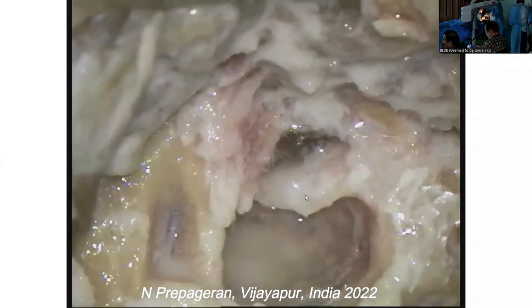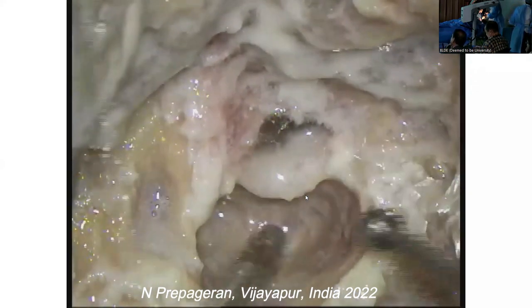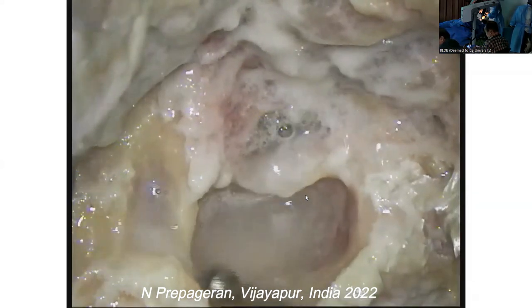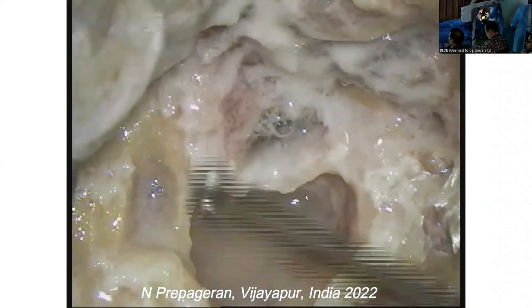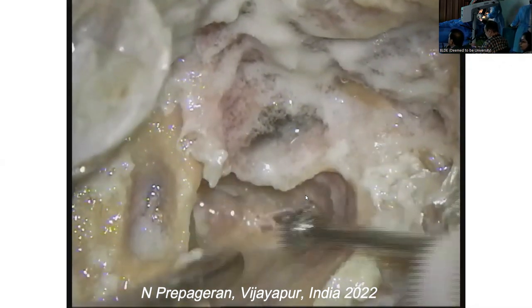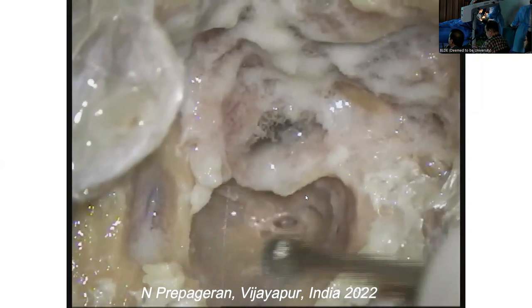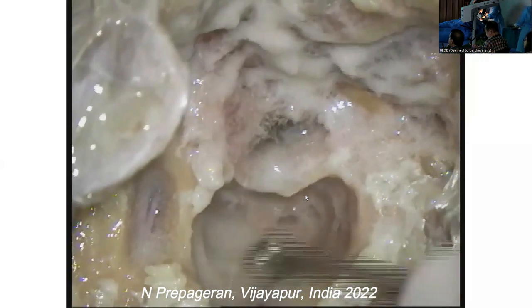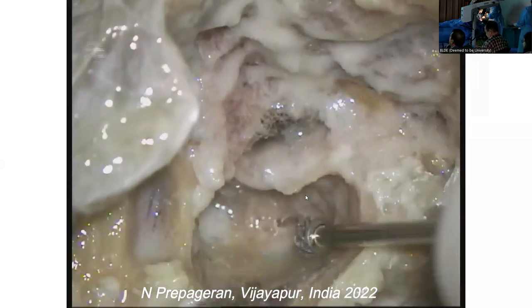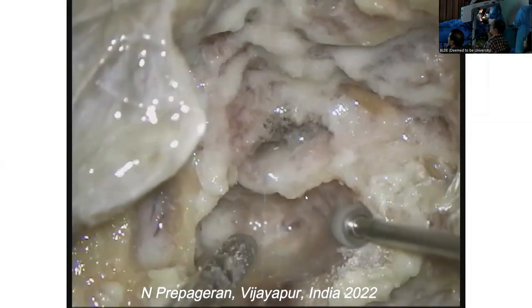So when you do this, you want to do it with a shorter shaft and with a big burr. A small cutting burr like this, you will, so that's the dura of the pre-sigmoid. Okay? So now, that's probably a sigmoid sinus. Guys, can you see that? Yes. So now let's do retro sigmoid.